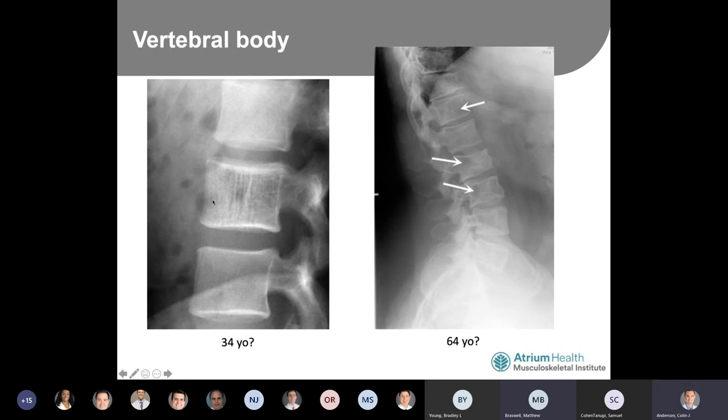Just to keep things moving, I'll tell you that this is a relatively classic appearance. It's a somewhat poorly circumscribed lesion. You do see the bony trabeculae stand out a lot, these striations. This is a classic appearance for an incidental hemangioma. But infection and EG are also worthy to keep in mind on the differential.